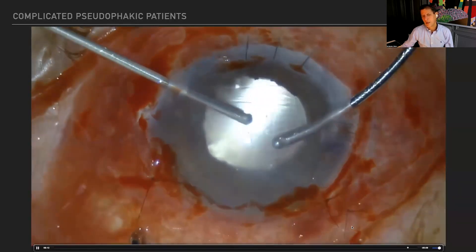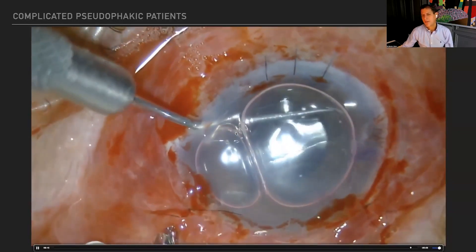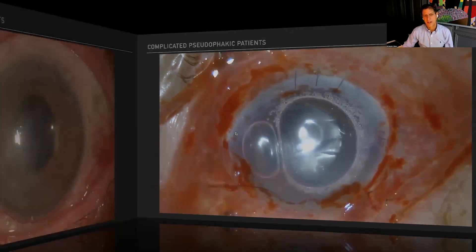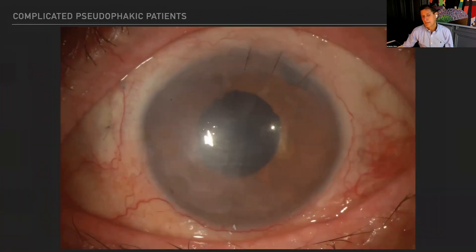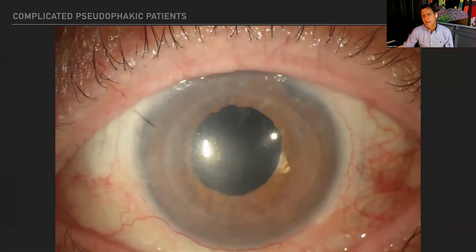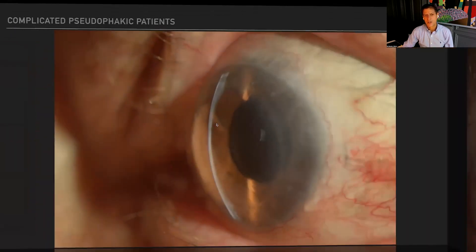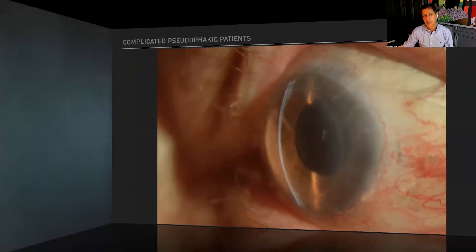We aspirate viscoelastic and confirm the lens sits perfectly in place with no synechiae. Postoperatively, just after the explantation and IOL fixation, we can see the haptics transilluminating through the sclera. After the subsequent DSEK in the same case, the sutured cornea is nice and clear — we have solved a very difficult case.